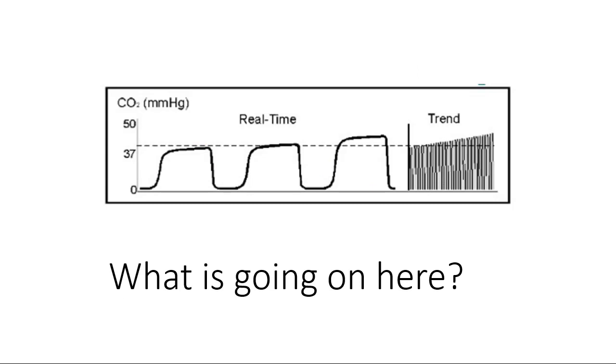So here you go. This is a patient you've intubated, and you have the fireman or EMT bagging them. You notice that your end-tidal CO2 is rising. This is not a cardiac arrest. You look here at your trend. Notice your trends.